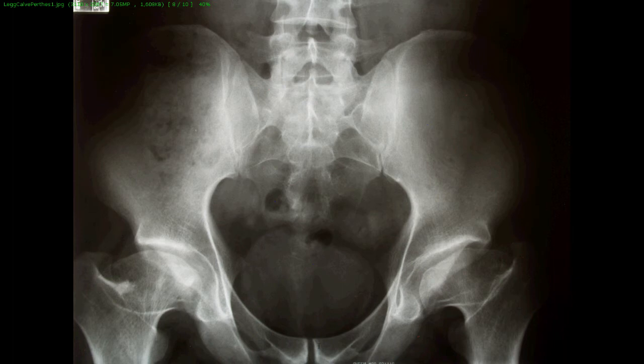So the major radiographic findings we have in this case are the flattening and mushrooming and deformity of both femoral heads, along with some sclerosis of the joint margins and the acetabular roofs. These changes are consistent primarily with two conditions that occur during childhood, those being slipped femoral capital epiphysis, a Salter-Harris 1 fracture, and Legg-Calve-Perthes disease or avascular necrosis of the femoral capital epiphyses.